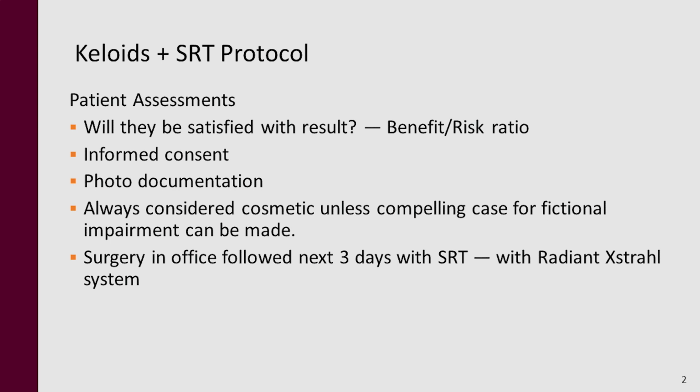In the past, I've had patients, as many of you probably have, with keloidal scars or hypertrophic scars following chest cracking for a bypass procedure. I've done very few on the chest. It's more difficult. The chance for recurrence is greater, whereas on the ear, at least so far, I haven't had any recurrences, so it's done pretty well.